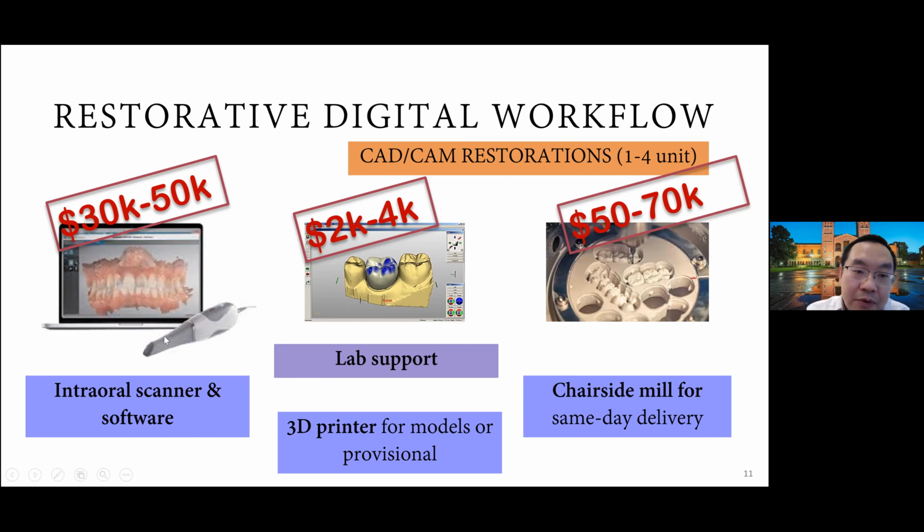Another hidden cost, I wouldn't say hidden cost, is sometimes there's also software upkeep. Almost like Office nowadays, there's a subscription model. Every year you have to pay a subscription fee for your own scanner system. Sometimes they charge an upkeep fee. So depending on who your distributor is, who your reseller is, you have to figure that out between you and the reseller and distributor. Sometimes they charge a case by case fee as well. So every case you do, especially for Invisalign, they charge a fee for each case that you do, okay?